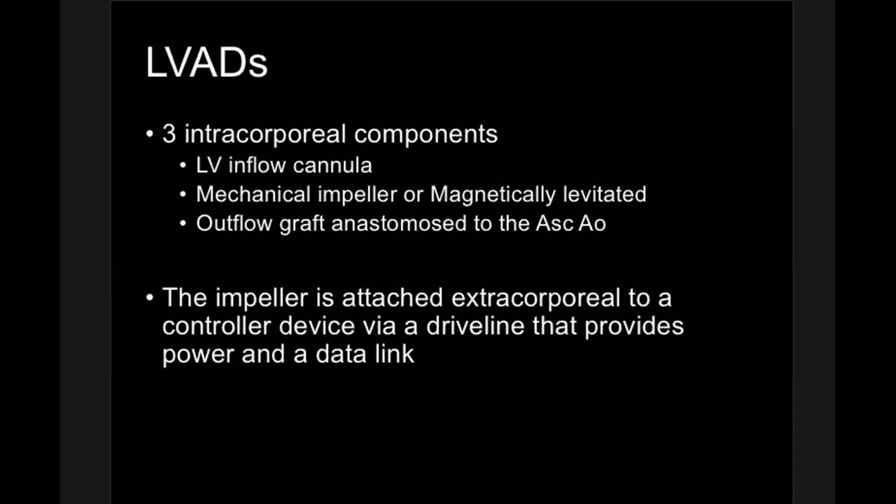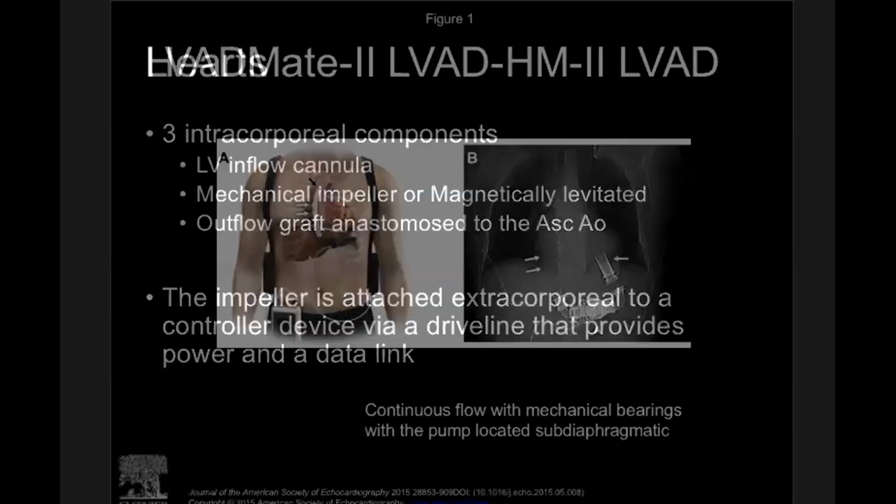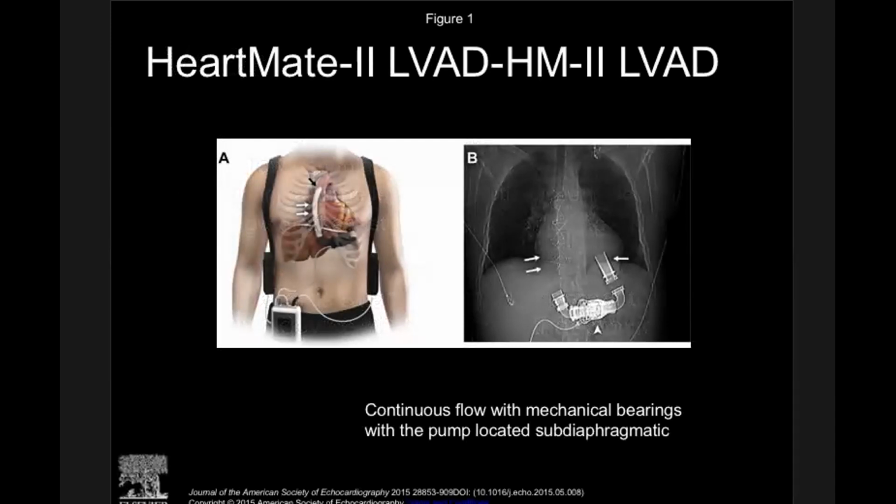Avoid overheating the patient's internal organs. This is just a schematic of the HeartMate 2 LVAD. This is a continuous flow support system with mechanical bearings, with the pump located subdiaphragmatic. So as you can see, the pump is subdiaphragmatic. Then parasternally, you can see the outflow graft, which is then attached to the ascending aorta.